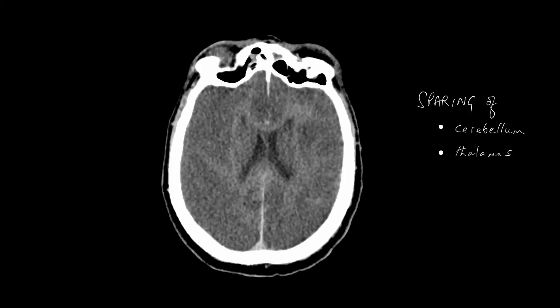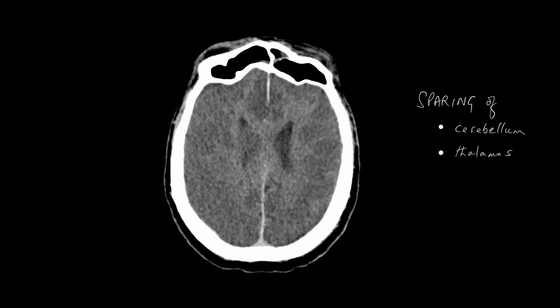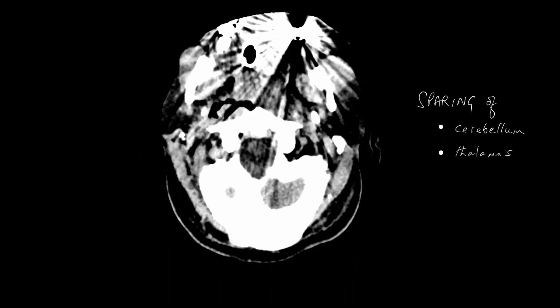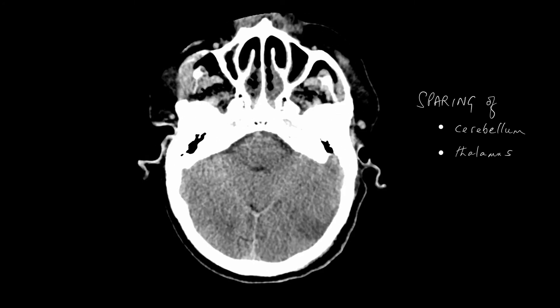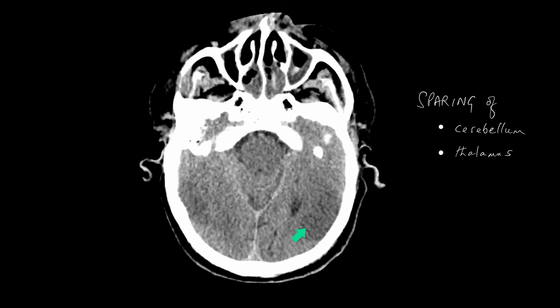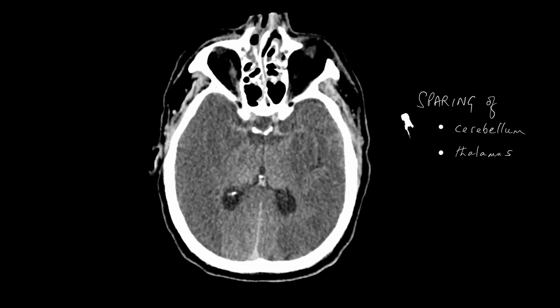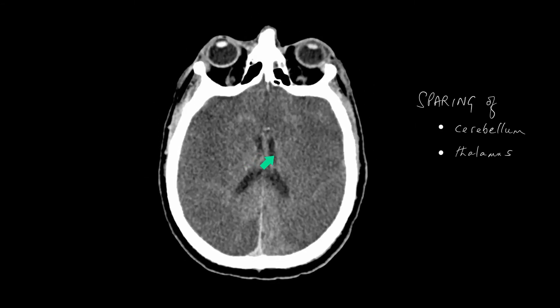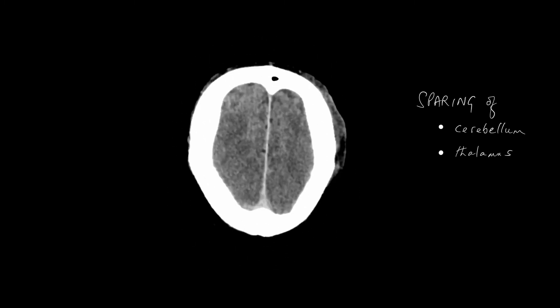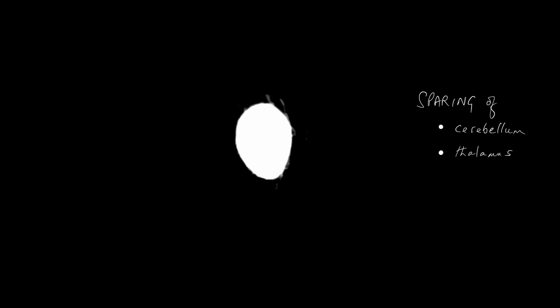Here is another patient who has got global hypoxia. You can see that the cerebellum is of normal density pretty much. There is an area of reduced density here, and if you look at the thalami they tend to be of normal density. So this is global anoxia giving sparing of the cerebellum and thalamus, but also demonstrating the pseudo-subarachnoid sign.